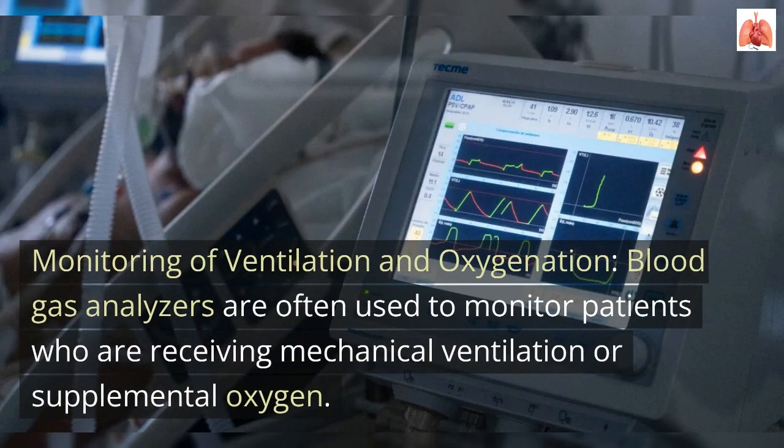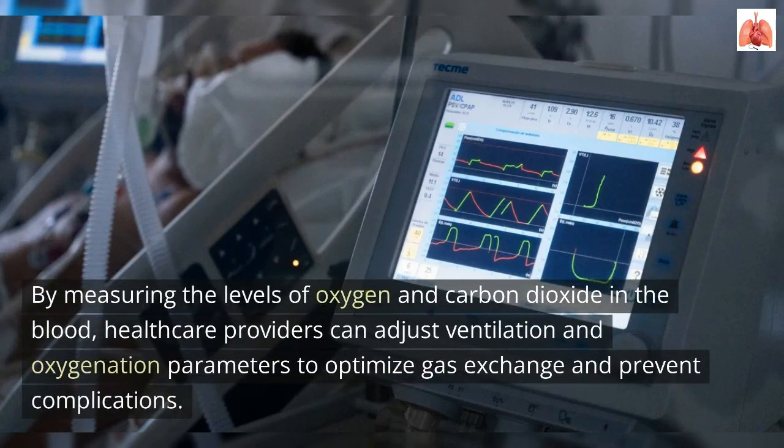Monitoring of ventilation and oxygenation. Blood gas analyzers are often used to monitor patients who are receiving mechanical ventilation or supplemental oxygen. By measuring the levels of oxygen and carbon dioxide in the blood, healthcare providers can adjust ventilation and oxygenation parameters to optimize gas exchange and prevent complications.